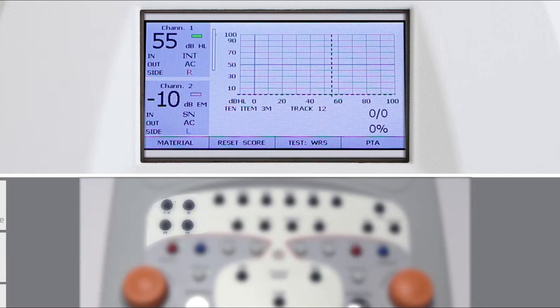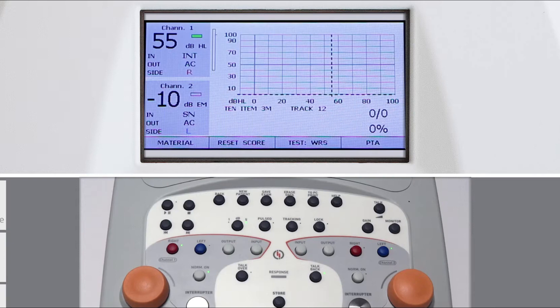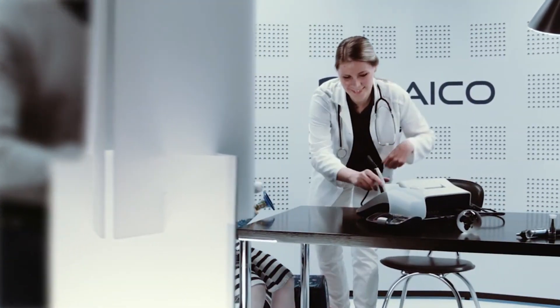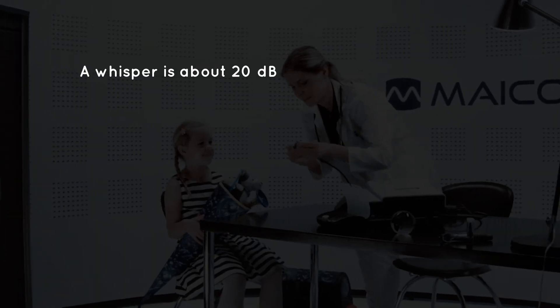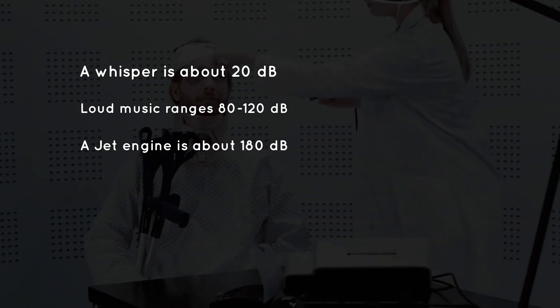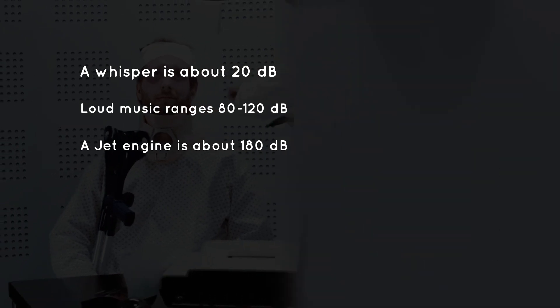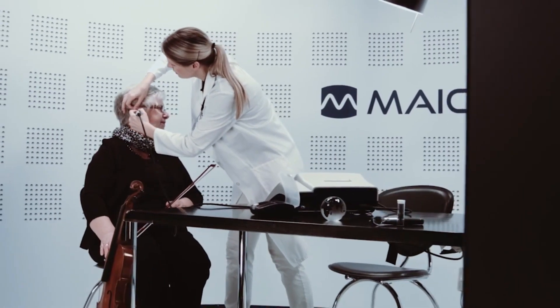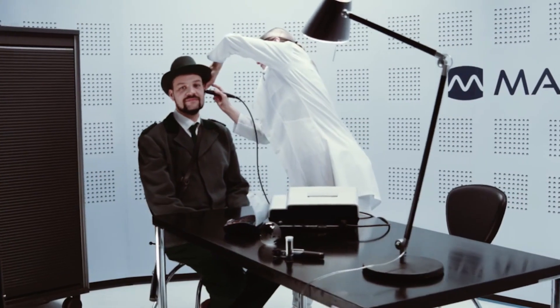A pure-tone audiometry test measures the softest or least audible sound that a person can hear. During the test, you will wear earphones and hear a range of sounds directed to one ear at a time. The loudness of the sound is measured in decibels, or dB. A whisper is about 20 dB, loud music ranges 80 to 120 dB, and a jet engine is about 180 dB. The tone of sound is measured in frequencies, or hertz. Low bass tones range 50 to 60 hertz, and high-pitched tones range 10,000 hertz or higher. Normal hearing range is 250 to 8,000 hertz at 25 dB or lower.